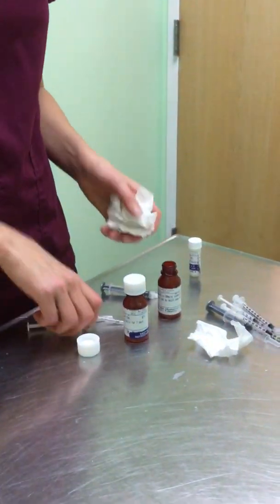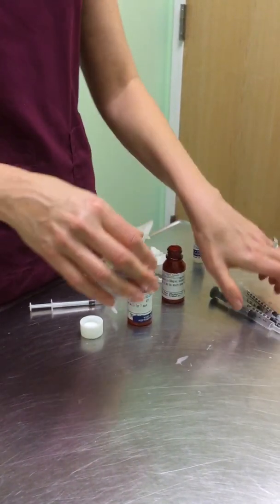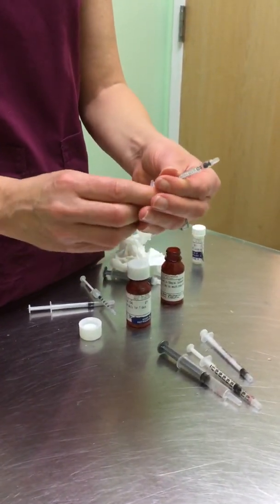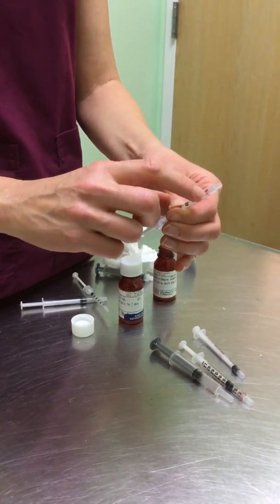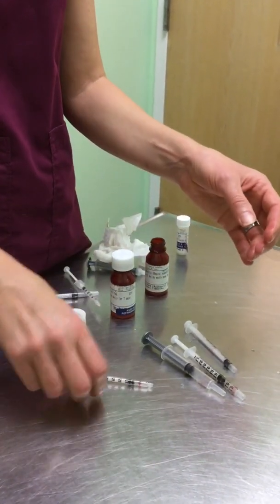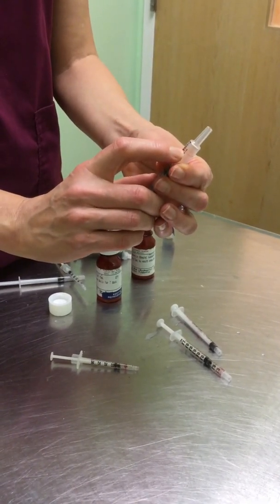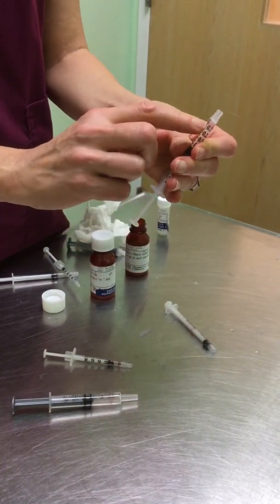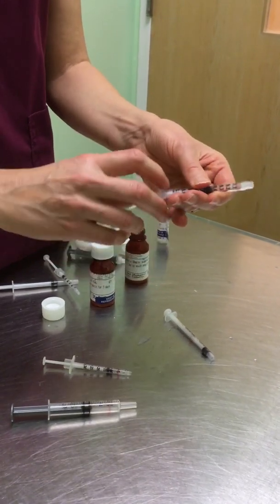Now, I wanted to also let you know that we at the center, if you are especially a new client to us, we will not send you home without giving you syringes that are pre-marked. We don't want you to be confused because we know this is confusing. So you're gonna get a syringe that has a red line on it, piece of tape. If it's 0.05, you're going to see the little red tape. If it's 0.05 and you want a larger syringe, you're going to have some tape here on the appropriate mark. And again, 0.05 with the red line is going to be right here. So we will try to make it as easy for you as possible.